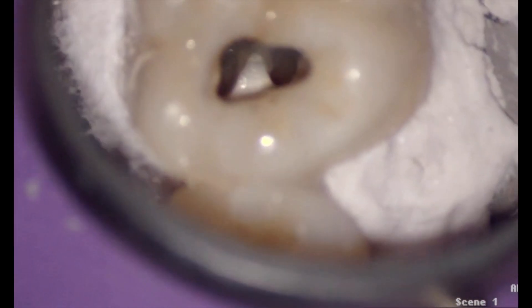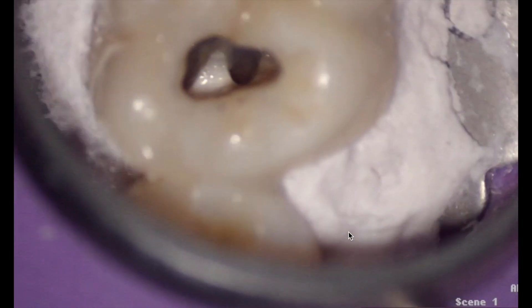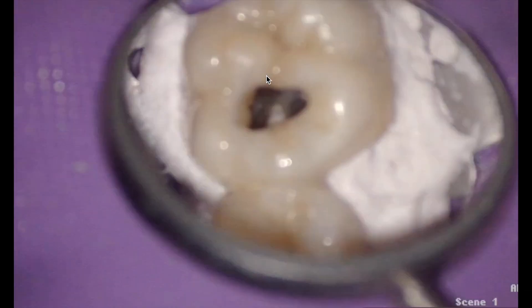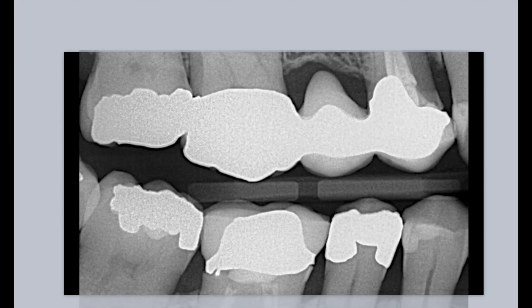If you don't have proper magnification and feel unconfident, don't do it. But if you do see the MB2 and have a hard time getting down the canal, order some Muntz burrs and do a little bit of troughing — you can do this with 4x loops or even 3.5x. Trough that mesially and it'll make a huge difference getting down those pesky MB2s. Tip number one was to look at the bite wing to confirm there is space, then watch the video, practice on extracted teeth, and you're good to go.